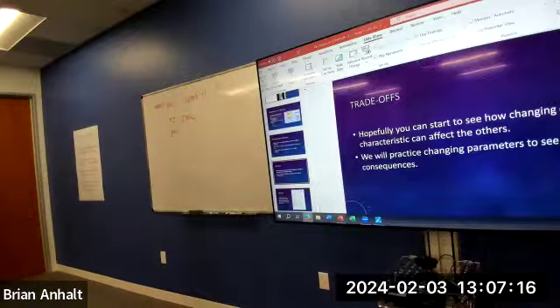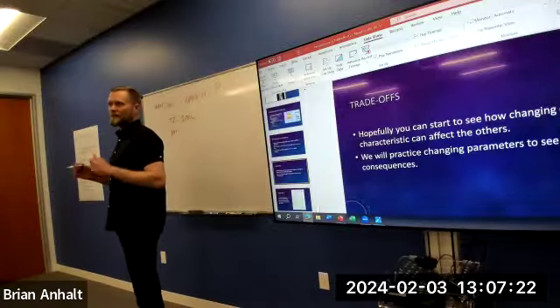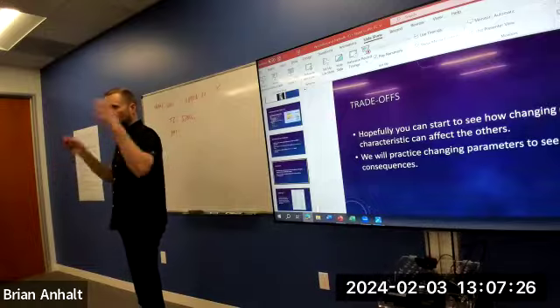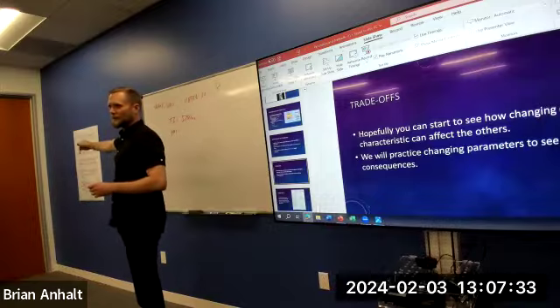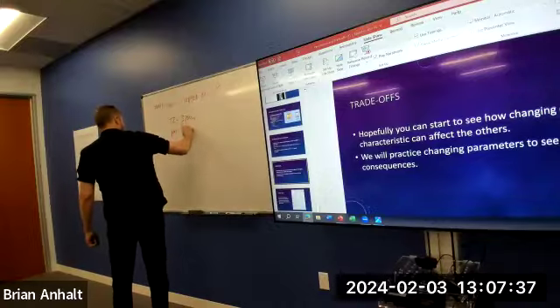It says 512 by 512. So it's 512, right? If it gave me a lower number, that would be the phase matrix. So keep that in mind. If your matrix is anisotropic, the lower number is always your phase matrix. No reason to go higher in phase than lower in frequency. It doesn't save you anything, right? The phase matrix is 512.